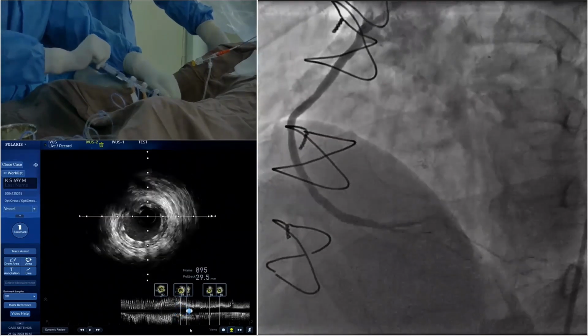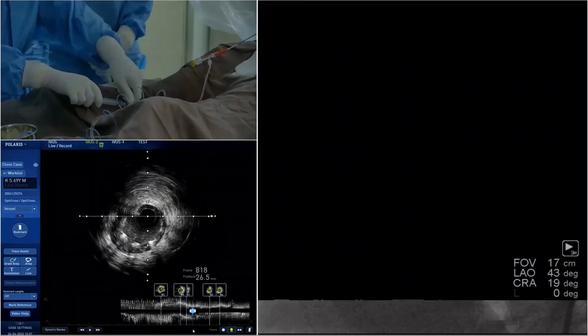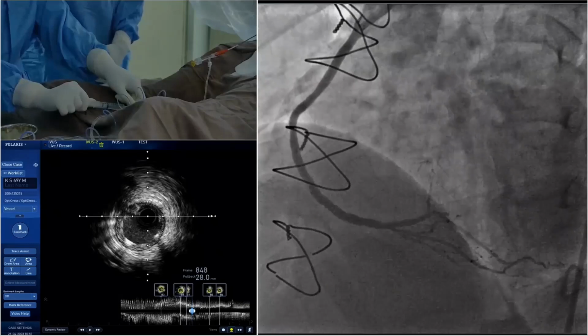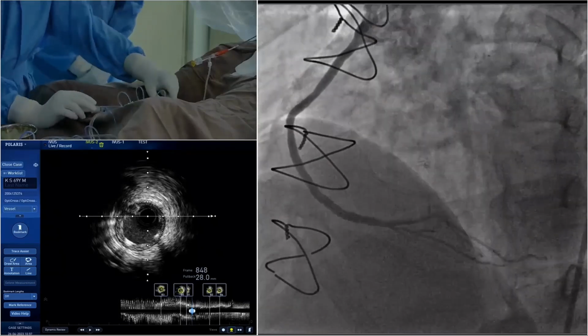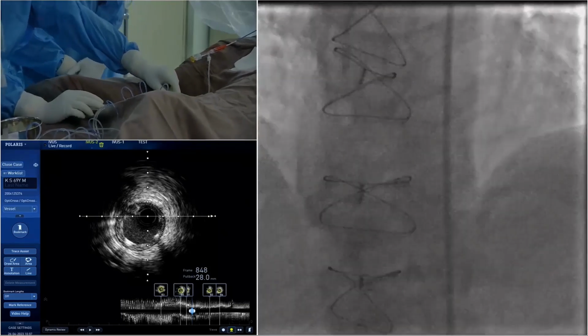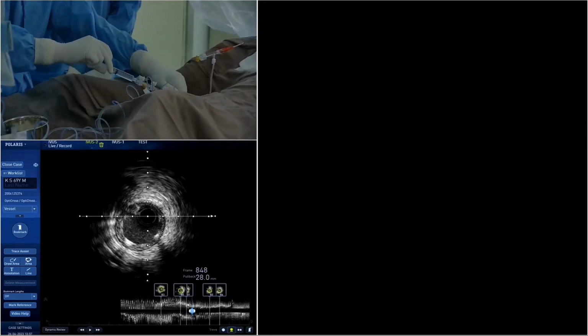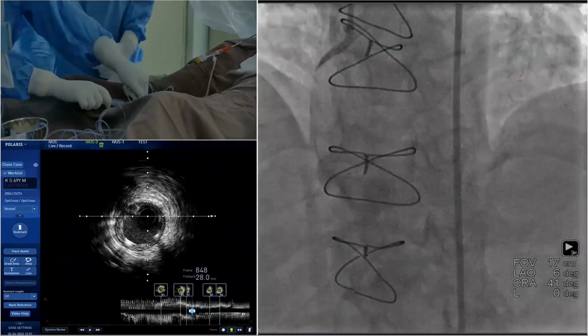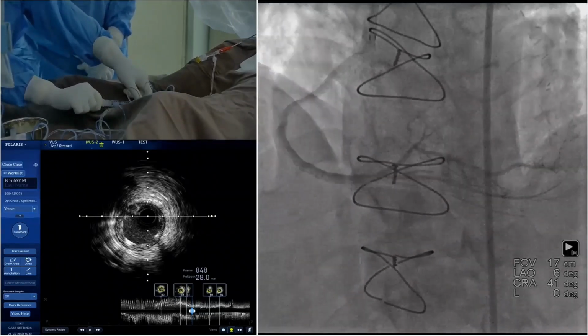And we hope you all enjoyed the case. And take another perpendicular view. Yeah. All right. It looks very nice, very good, and the result looks extremely pleasing.